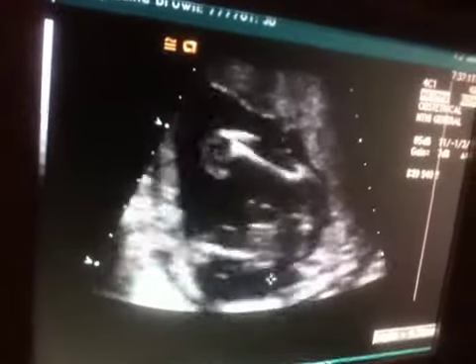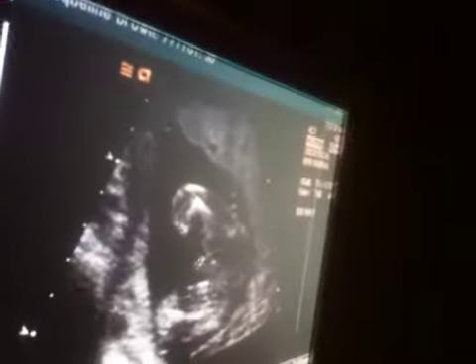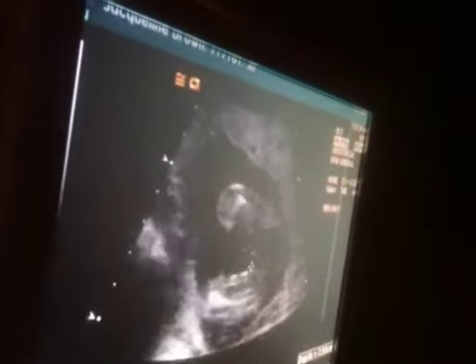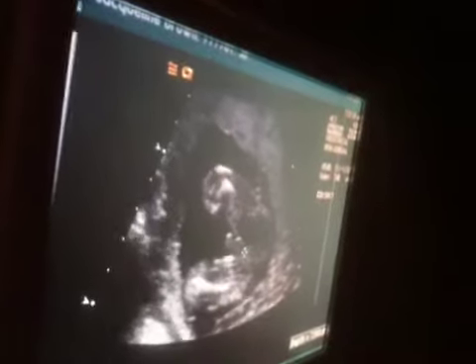This is the leg here, and then right between the legs, this is the penis right here, and then this is the scrotum right there. Can you kind of see that? Yeah.